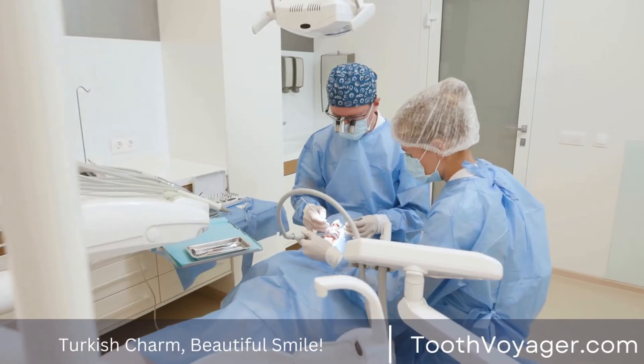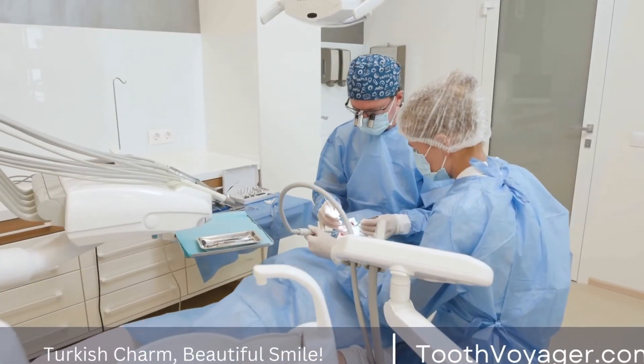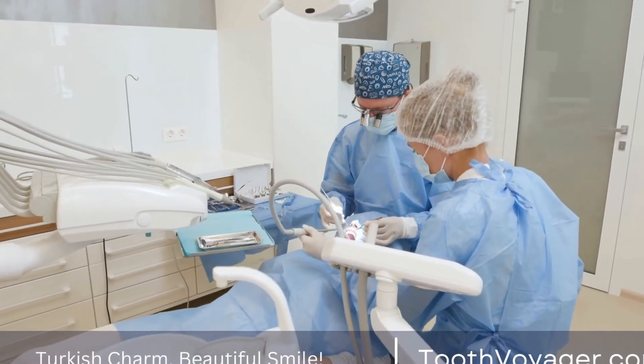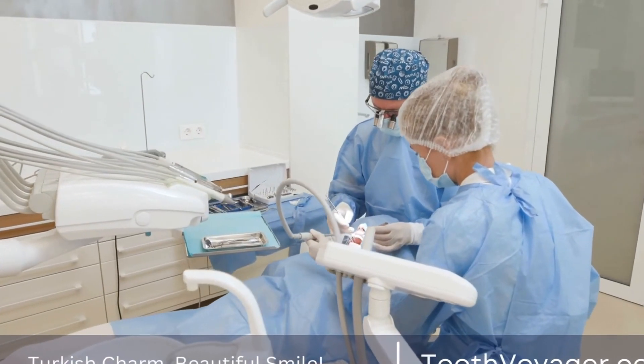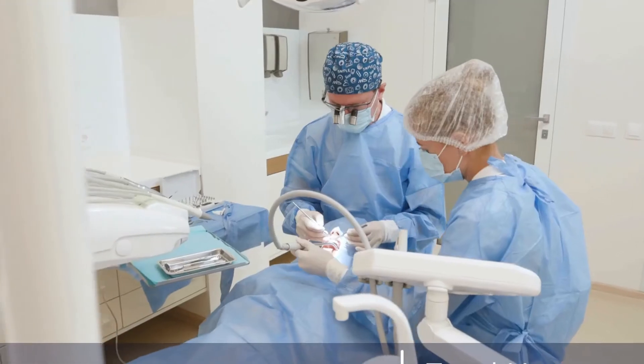Step 2 — Local anesthesia: To ensure your comfort during the procedure, the dentist will numb the area around the tooth with a local anesthetic.